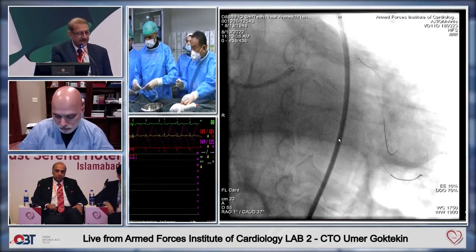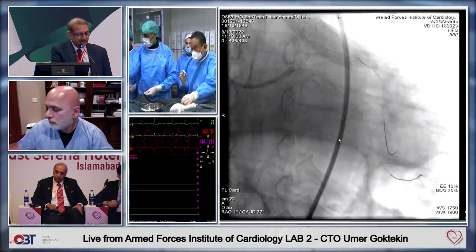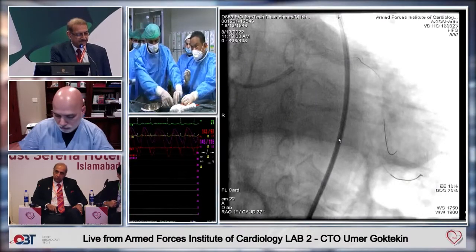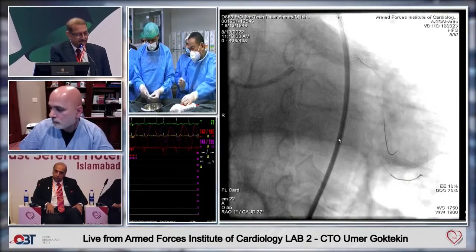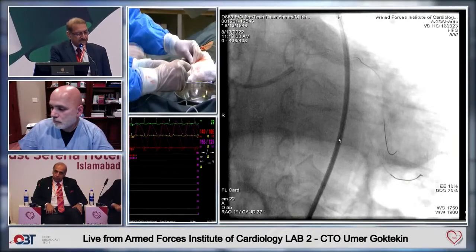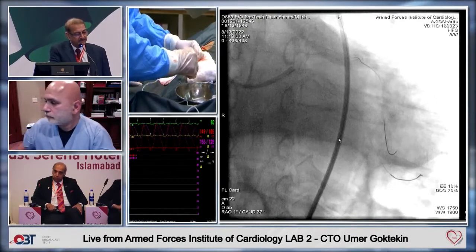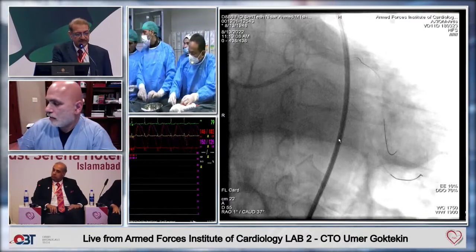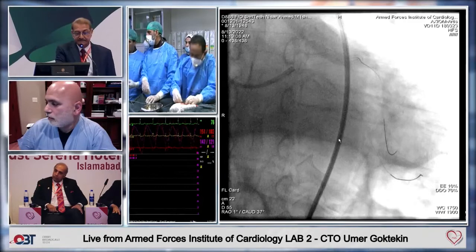Okay, that's fine. But really, if you have got some distance, then you may want to try to do the ostial LAD. But you will have to expect that you will get 1 or 2 mm of the stent into the left main. That's almost for certain. Otherwise, you most likely are going to miss the ostium. That has to be accepted. By the time you finish the procedure, we are now going to the second lab, which is ready. Can we go to the second lab, please?